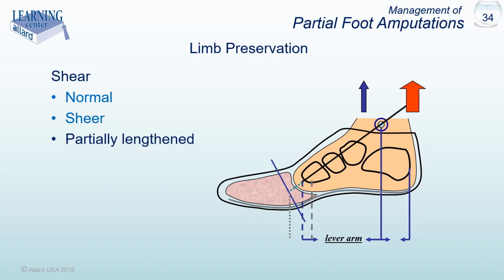Because of this, destructive shearing forces are still present and are only being partially managed. This is evidenced by the fact that most feet managed with this technique still acquire calluses. Some practitioners have even suggested that the calluses are worse using this method. There are no firm data that we're aware of.